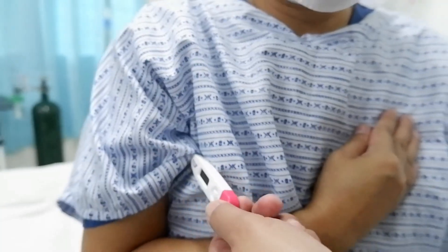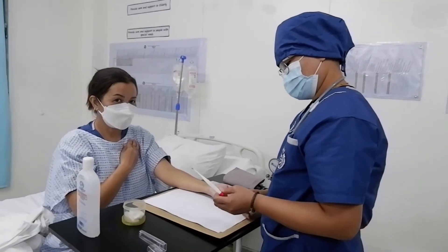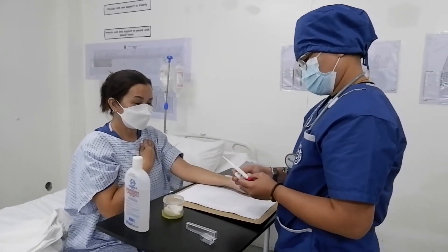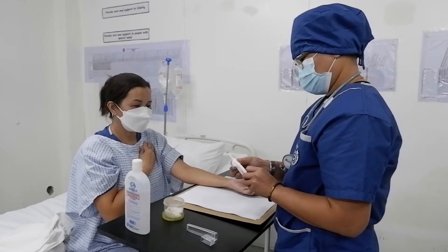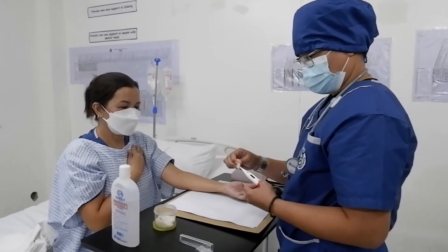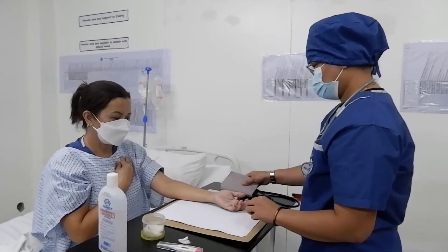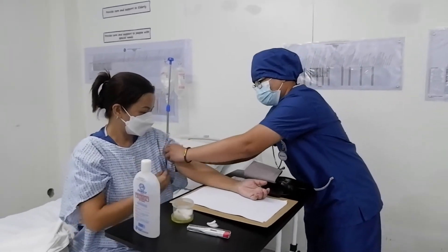After getting the pulse rate and respiratory rate, retrieve the thermometer and disinfect it with cotton with alcohol from stem to bulb. Then proceed to getting the blood pressure of the patient.